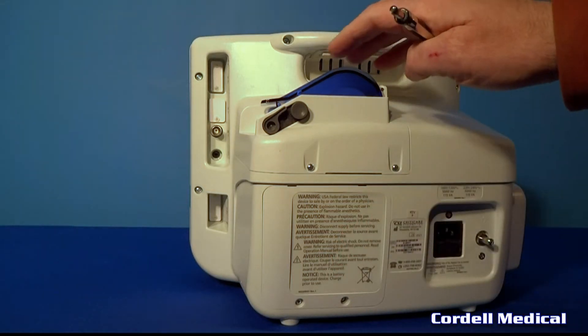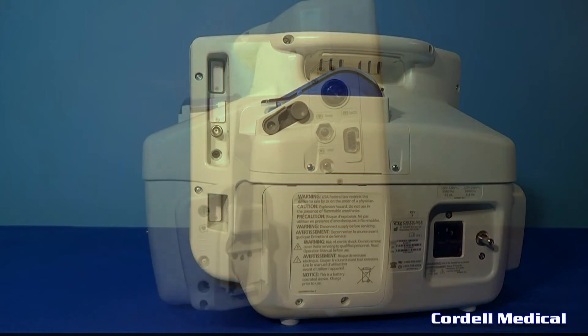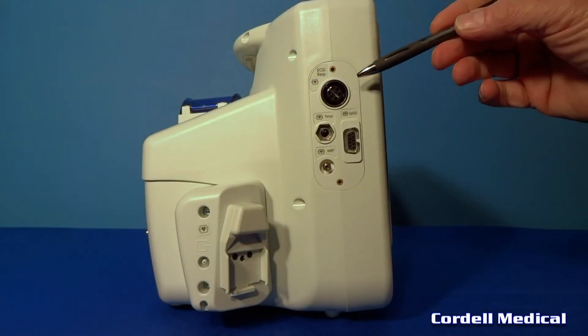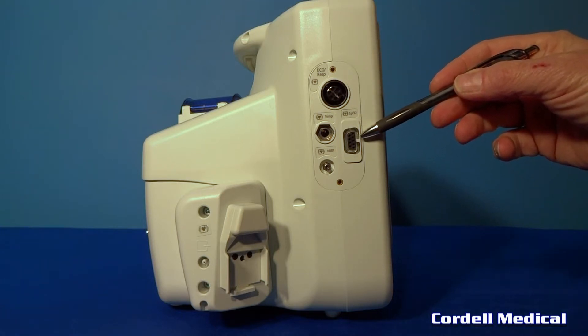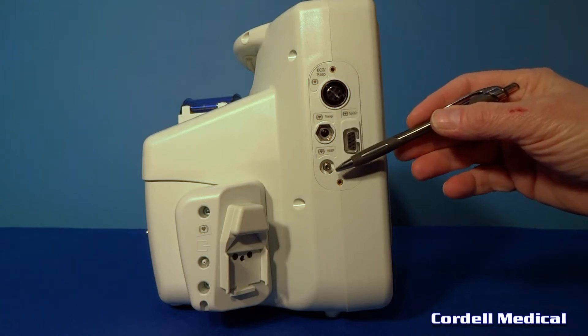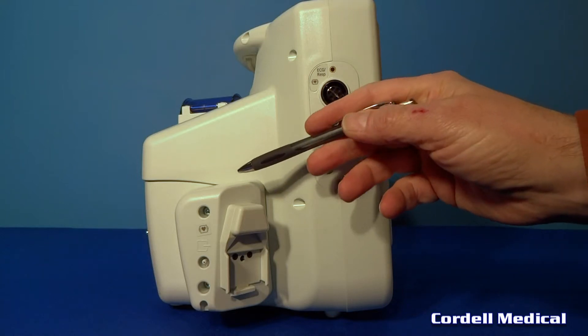There's a real-time printer included on this model. On the left side panel there is an ECG connection, an SPO2 connection, a temperature cable socket, an NIBP connection, and also the water trap connection.